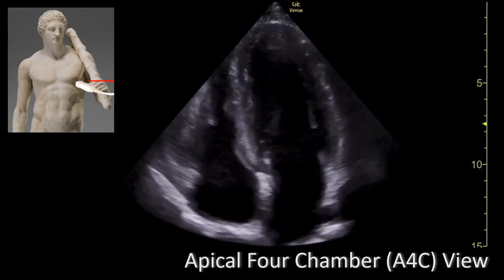Let's talk about the structures we're looking at. You have the left ventricle, the left atrium, and the mitral valve. On the opposite side, you have the right atrium, the right ventricle, and between those two structures you have the tricuspid valve.